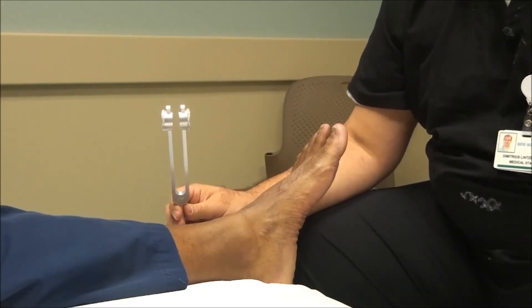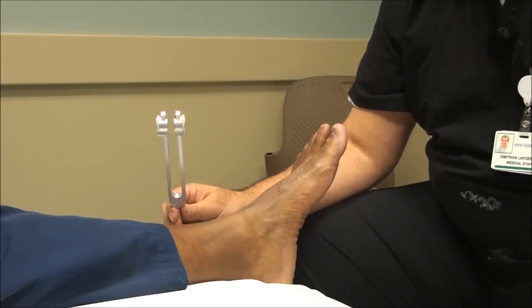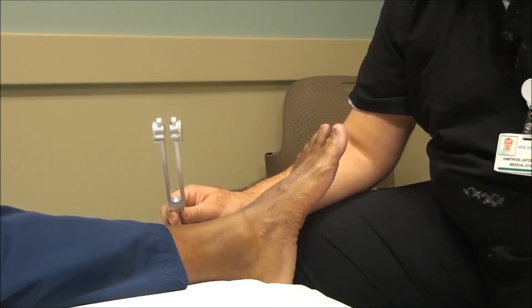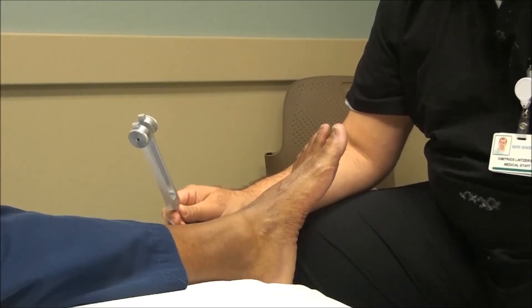Vibration sensation, when it's lost, can also be an indicator not only of diabetic peripheral neuropathy but it could also be an indicator of alcoholism, posterior column disease, syphilis, and vitamin B12 deficiency. So these should be in the differential diagnosis when you're looking at this test.